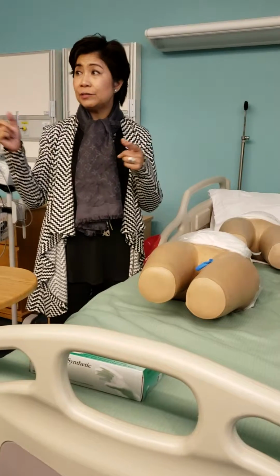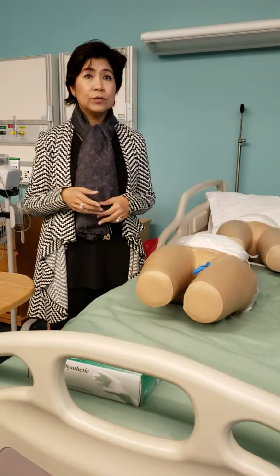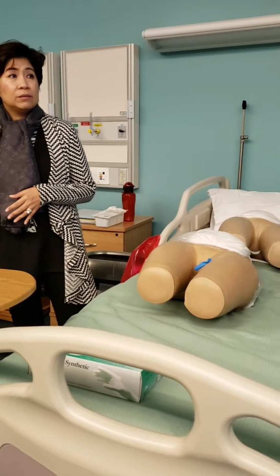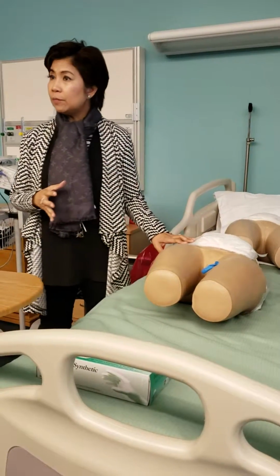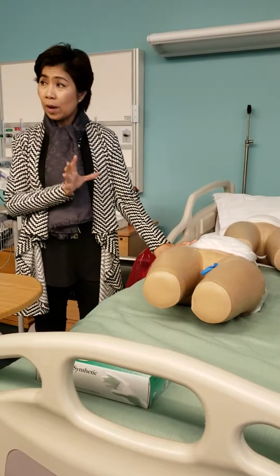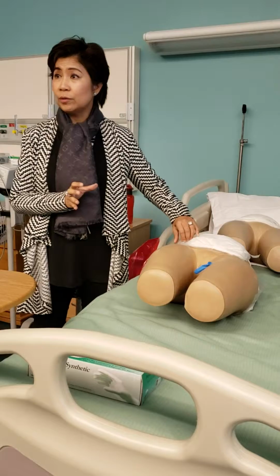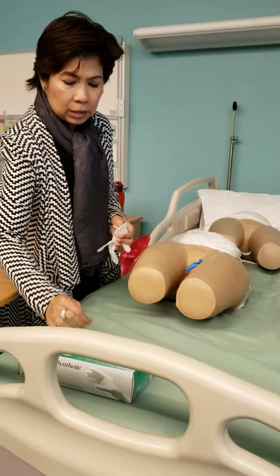It depends on a standing order from your doctor, whether the parameter is the pain is from 3 to 5, then you know the order is this. If it's more than 6, give this kind of pain medication, right? So let's say the patient said 0 out of 10 pain, so I can go ahead and proceed with my procedure. So I will start first with the dry dressing for the suture. It's a closed suture. I will get my clean gloves.